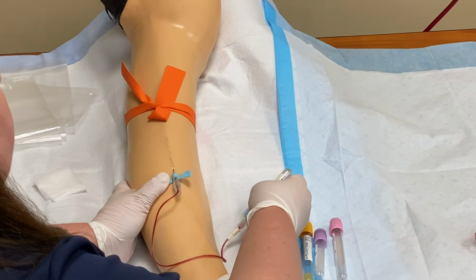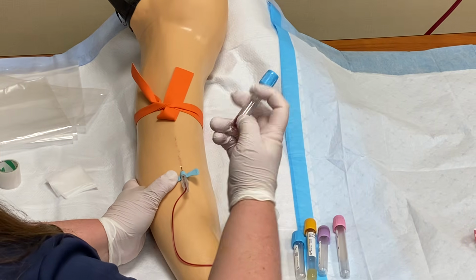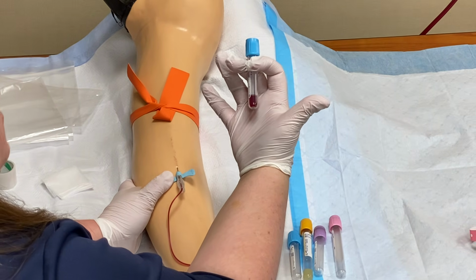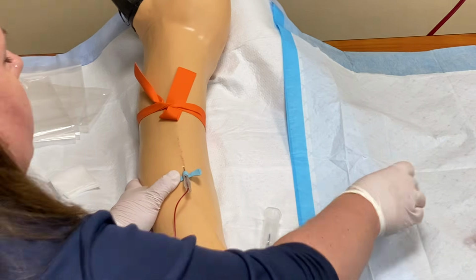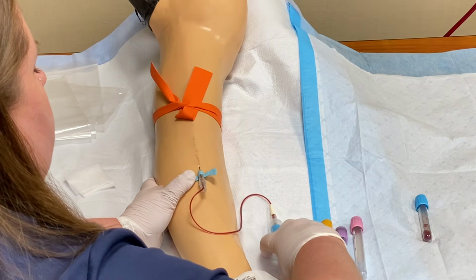So I'm going to use my waste tube first, and as soon as I get blood into that tube, I'm gonna pull it out so that I don't confuse it with my full tube, and I'll set that off to the side. So now I can fill up the rest of my tubes.